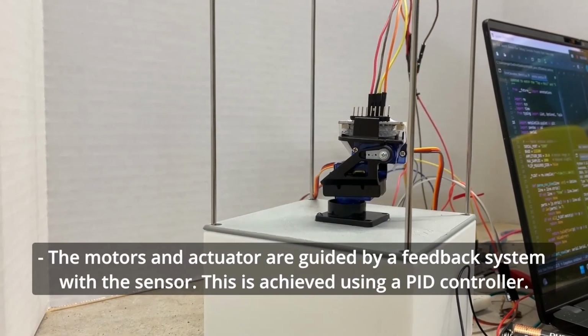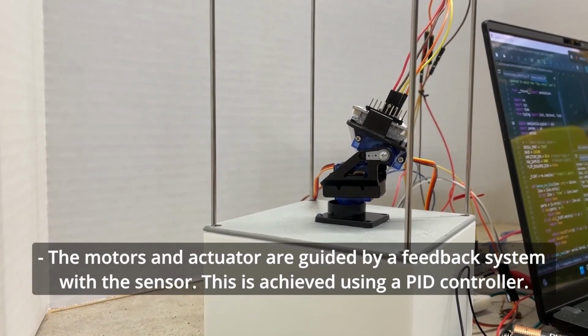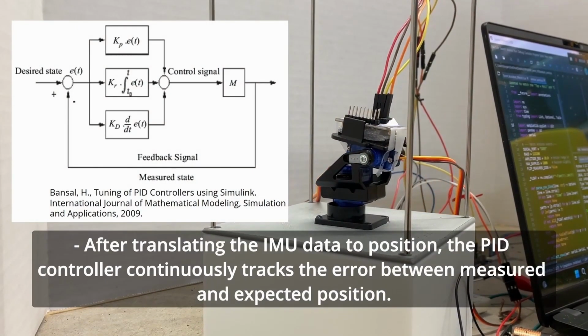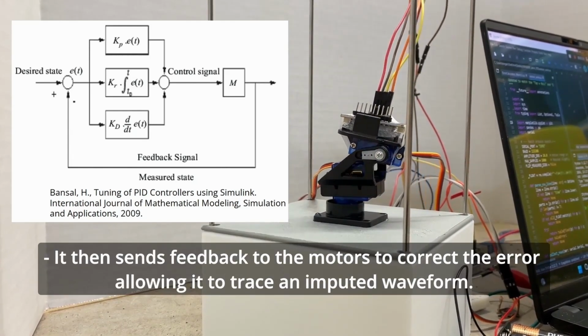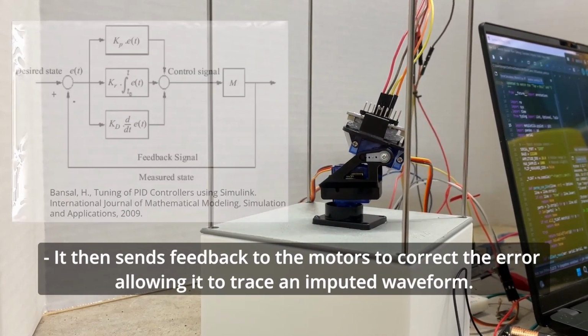These motors and actuator are guided by a feedback system with a sensor. This is achieved using a PID controller. After translating the IMU data to position, the PID controller continuously tracks the error between measured and expected position. It then sends feedback to the motors to correct the error, allowing it to trace an inputted waveform.